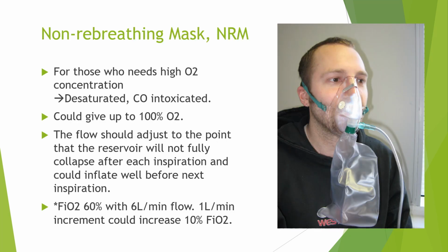And here, what we see is the non-rebreathing mask, abbreviated NRM. NRM is for those who need high oxygen concentration, where the patient may be desaturated or carbon monoxide intoxicated.